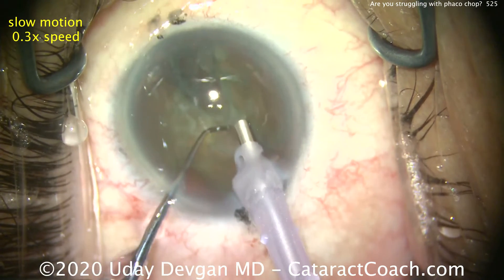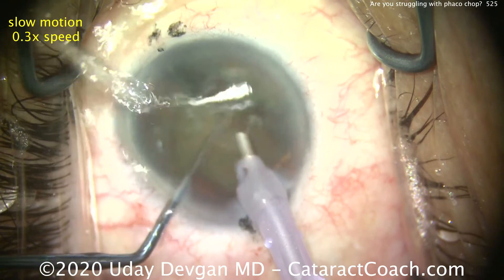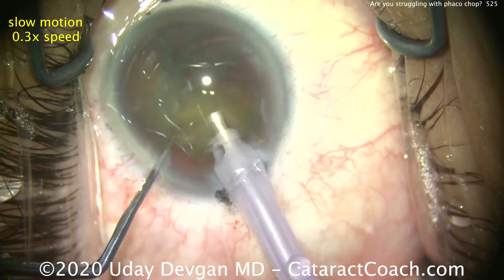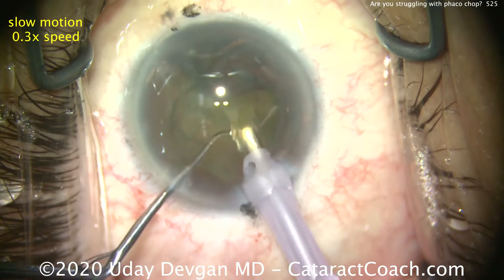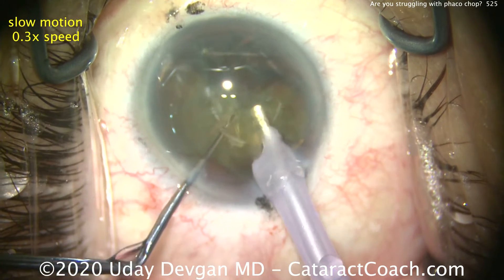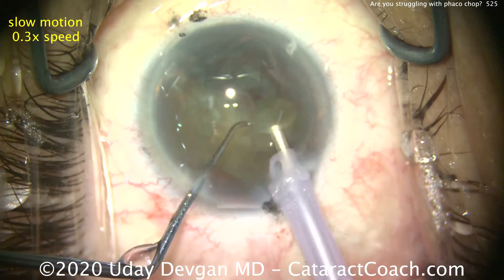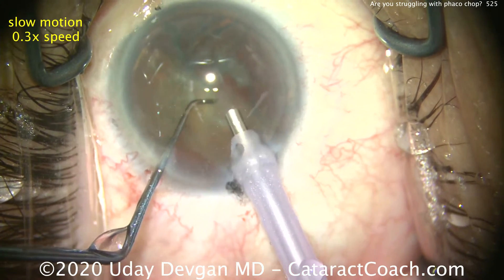Now it's buzzing again to the remainder of that first hemi nuclear half. So we can buzz in again, bring it up, and then either chop it again or simply emulsify it if the piece is small enough. Notice the chopper keeps pushing the piece in front. You want the nuclear piece to be in front of the FACO tip, not under it.